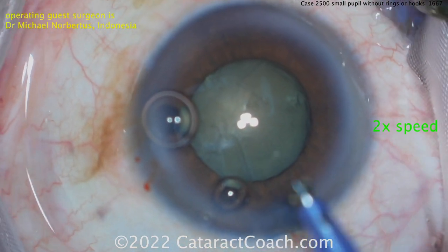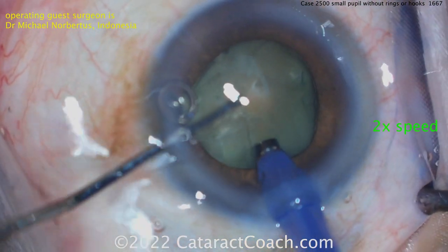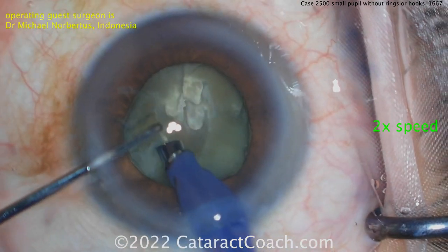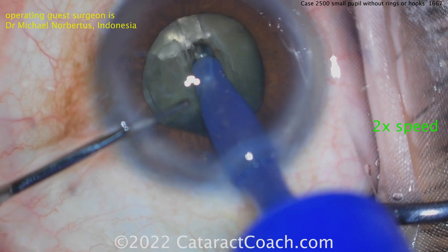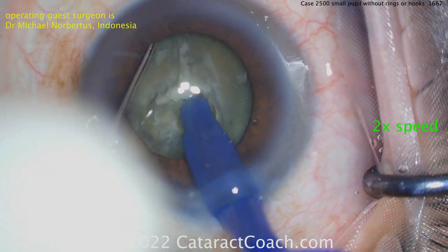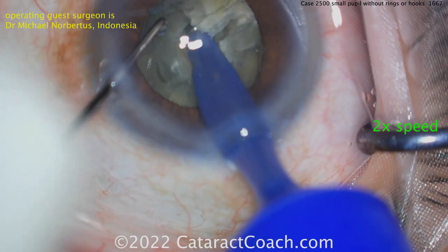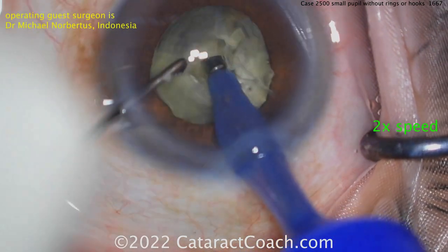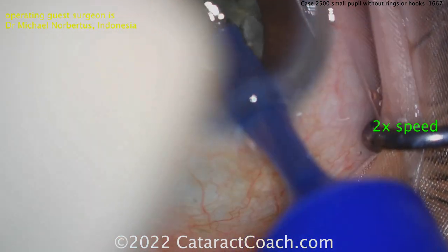Rotating it there with a hook or a chopper, phaco probe going inside the eye. Looks like it's just a pit - a pit to embed the probe and then do some chop. There's a central pit - nice, a pit technique with a horizontal chop. The purpose of that pit is to get the phaco probe embedded deeper into the denser part of the nucleus, not just the outer part. This lens has a good amount of density to it.